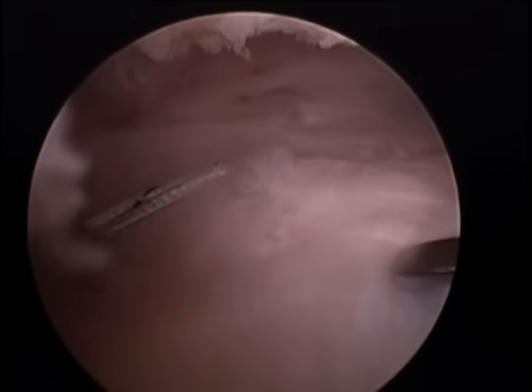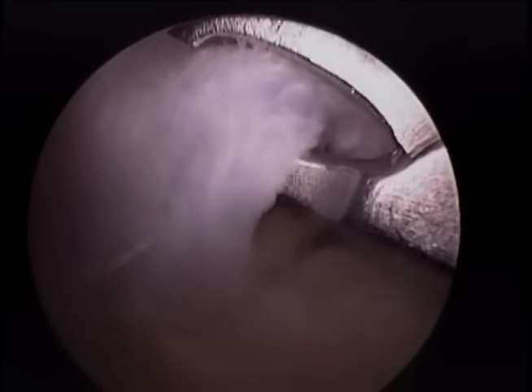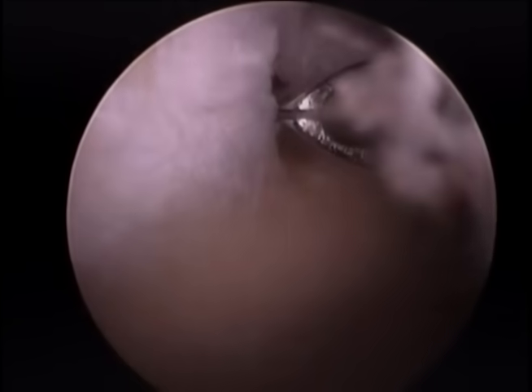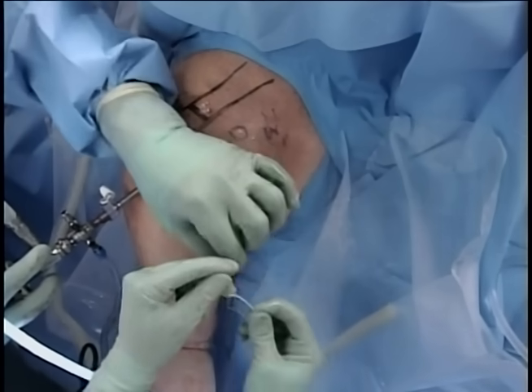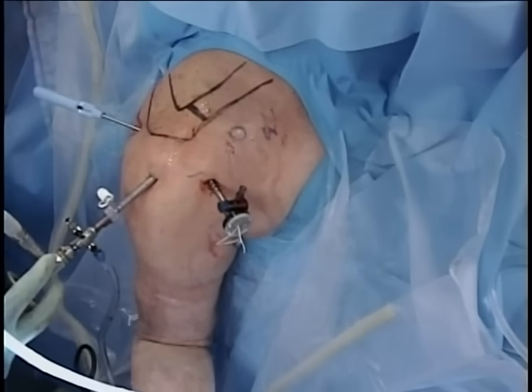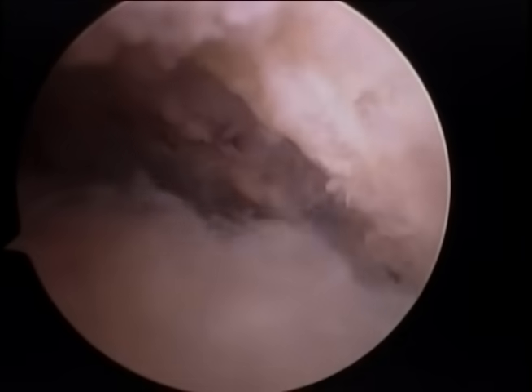Our grasper retrieves the last white suture and takes it out our anterior cannula. We again pierce the tendon medial to the tear, posterior to our other sutures. We produce our lasso and pull this again out our anterior cannula. We put the suture through the loop, you see this here outside the body, and then we pull the suture through the loop and again into the subacromial space, shuttling this through our rotator cuff tendon. All four sutures are now through the tendon, and we must grasp corresponding sutures to tie our knots.